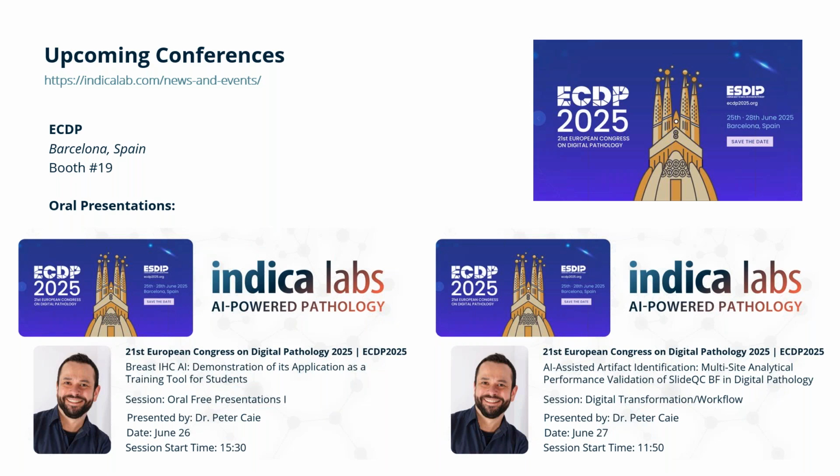Ghislaine, first question for you: is there a free trial version, or how can someone test Halo and Halo AI out somewhere? Yeah, of course. We do offer free trials for 30 days, and it means that you have exactly the same version of Halo as our customers and the same service as well. Our customers have unlimited support if you have annual licenses or are covered by maintenance. Basically, for 30 days, we'll be installing all the modules that you need to review, AI included, and we'll also be training you and helping you throughout.